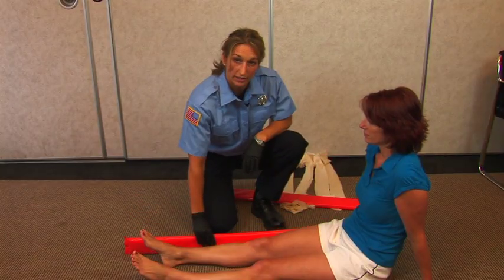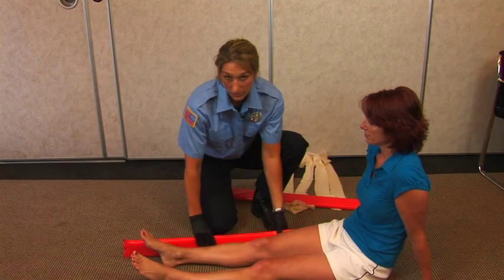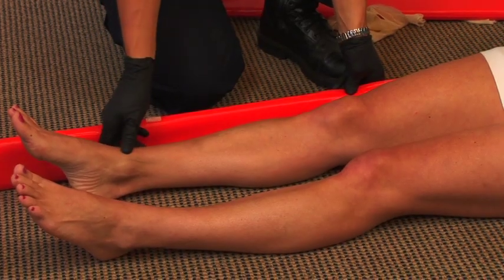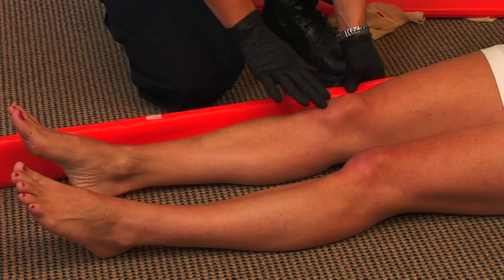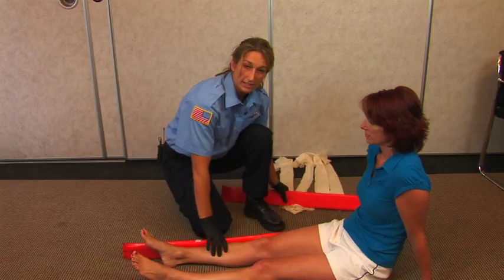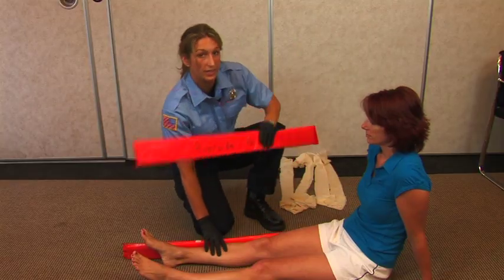You want to choose the appropriate length. When splinting, you want to make sure that you're splinting the joint below the fracture and the joint above the fracture. The preferred method is to have two splints, one on each side.